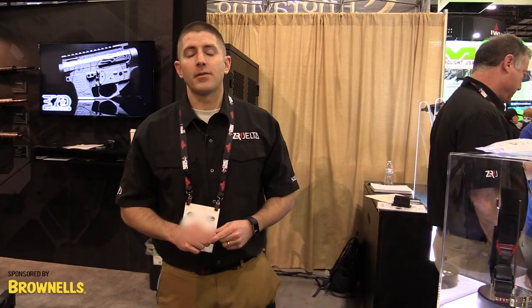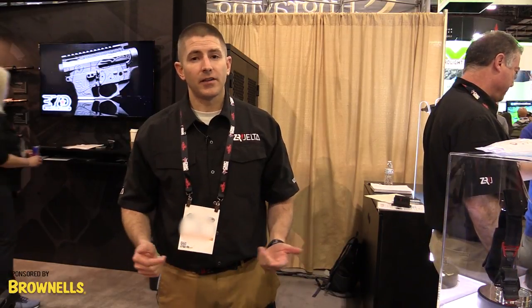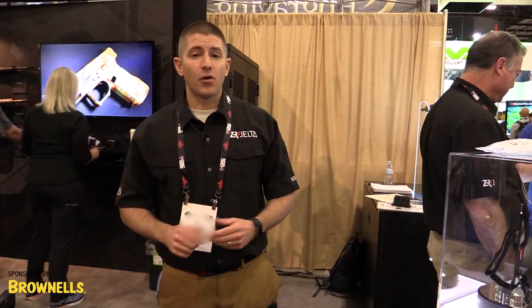That's all it takes. The lever is one of the most common mechanical advantages known to man, so we thought we would implement that in a tourniquet so that we could stop exsanguinating extremity hemorrhage faster, simpler, and more effectively. You can find this product at ZeroDelta.com, MSRP of $29.99.